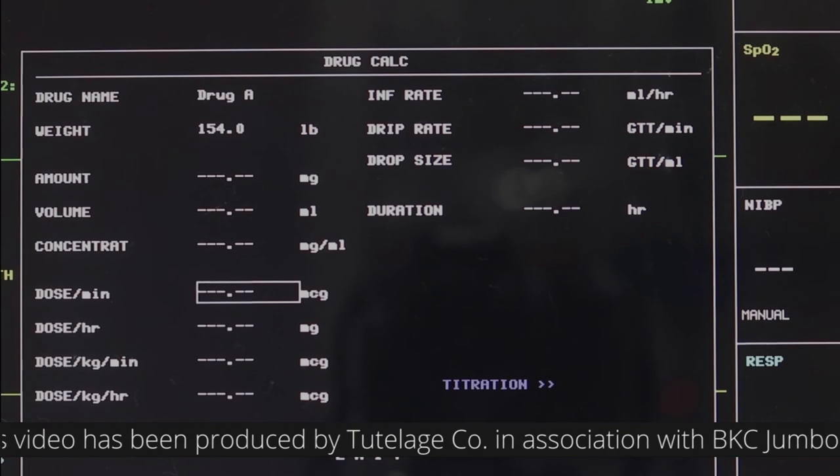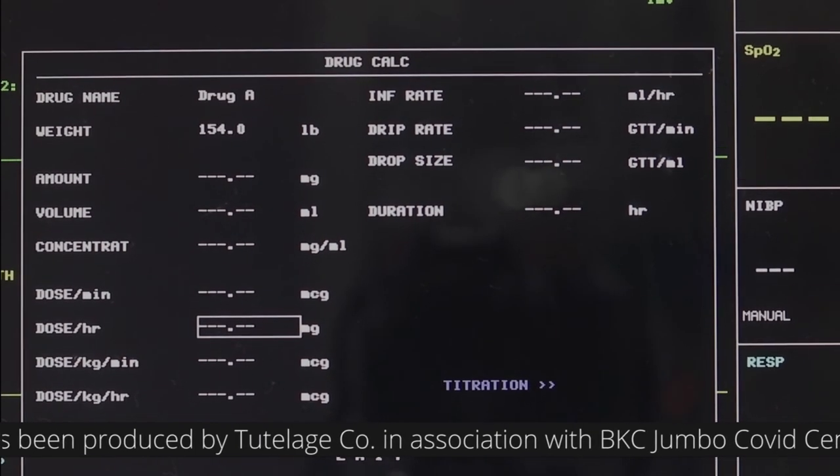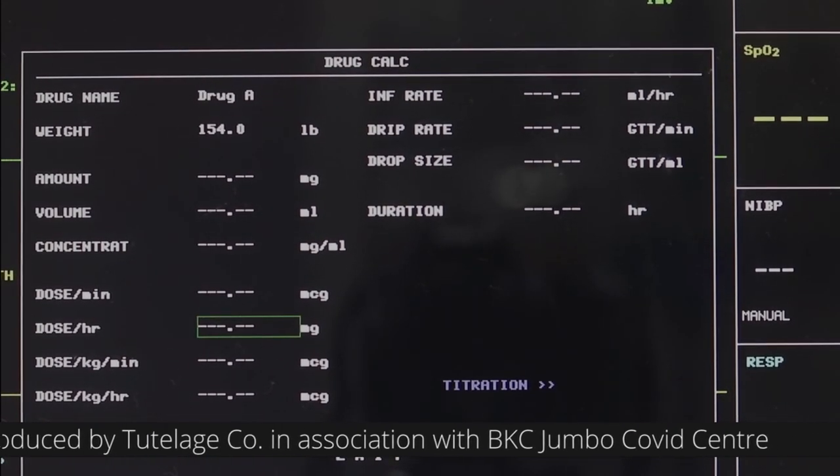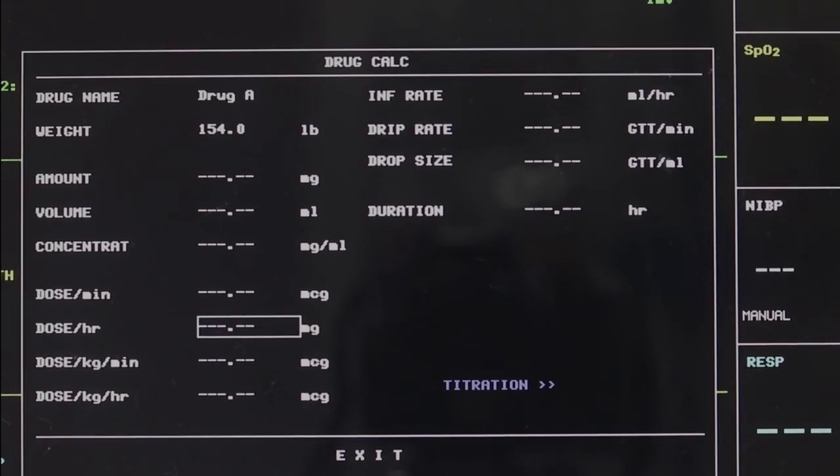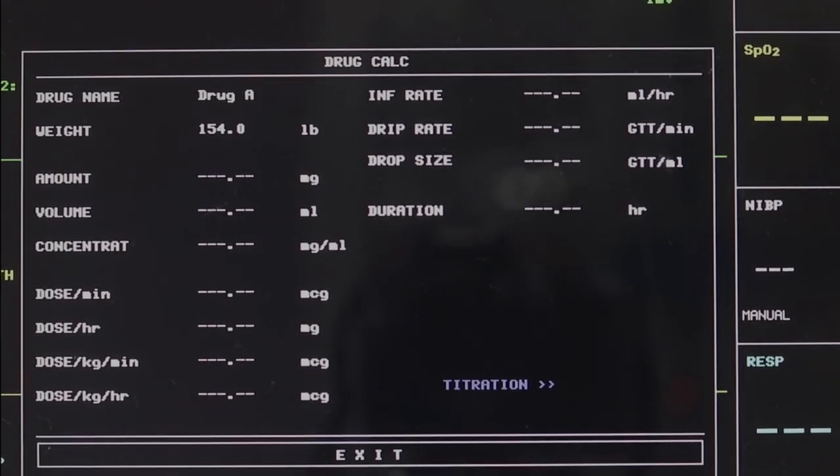In the Drug Calculation window, the operator should first select the drug name to be calculated and then confirm the patient weight. Next, the operator should also enter other known values. Each item has its calculation range.